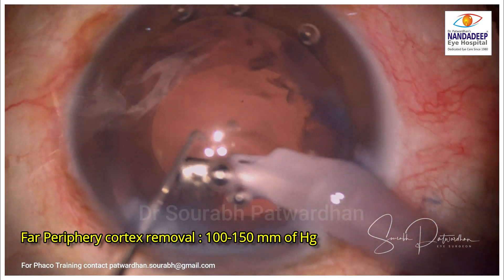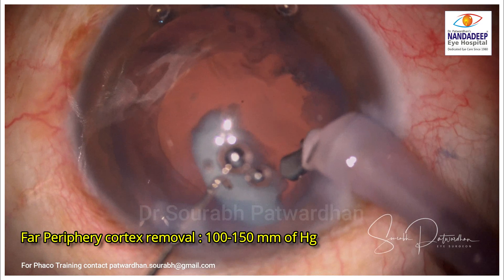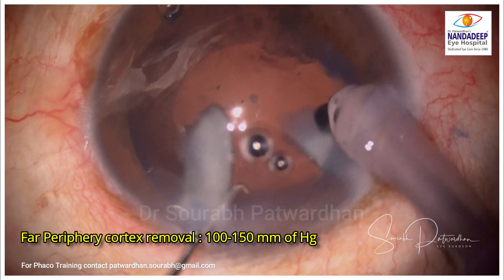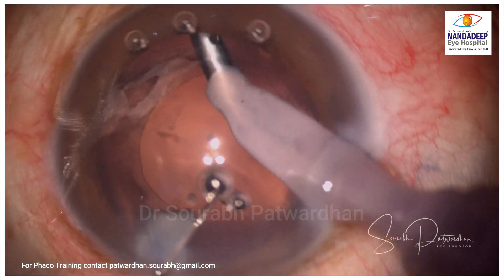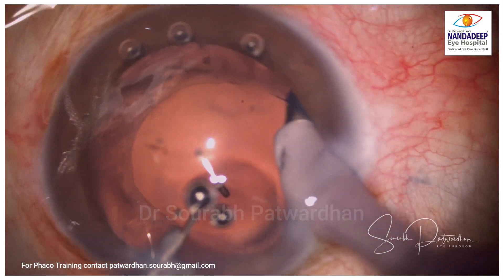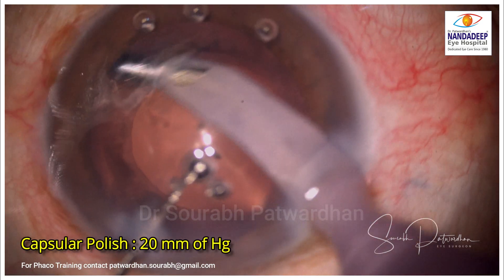You have to pull the cortex, and as you can see here there is some epinuclear sheet — just similar to a shimmering ring — which you have to take out. For this purpose we generally use a vacuum of 100 to 150 mmHg. Avoid using very high vacuum here because you are working very near to the equator of the lens and you may catch the anterior or posterior capsule, causing either a posterior capsular tear or anterior dialysis. So it's better to use 100 to 150 mmHg.